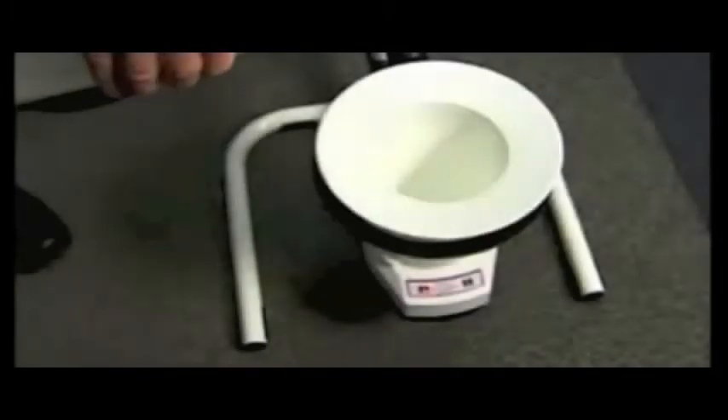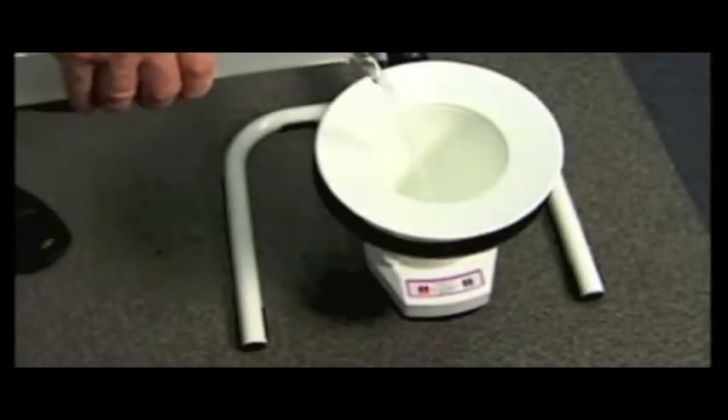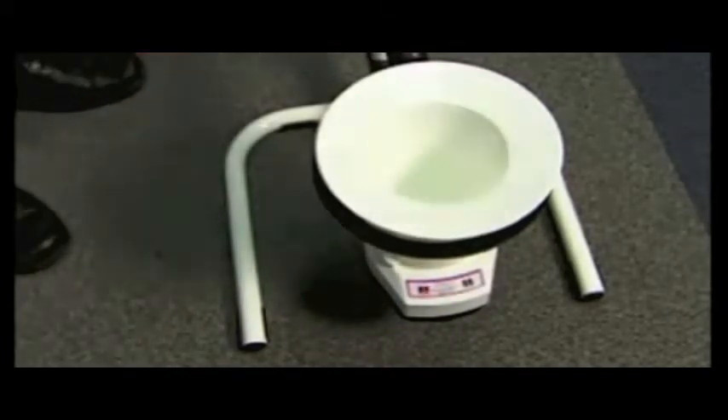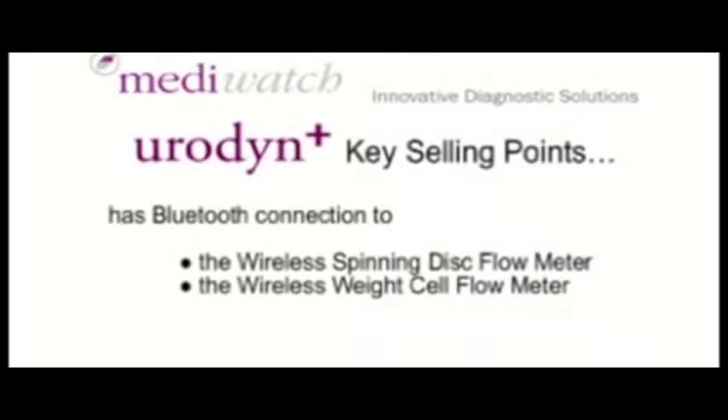The wireless weight cell flow meter is also ideal for patients to use at home. It runs on battery and can store up to 100 uroflows for later uploading. Urodyne Plus has Bluetooth connection to the wireless spinning disc flow meter and the wireless weight cell flow meter.